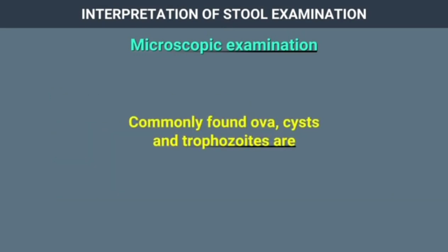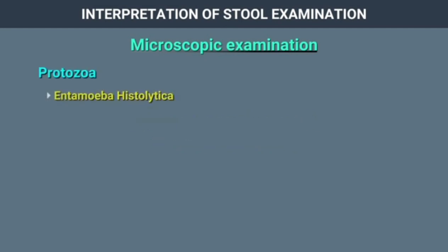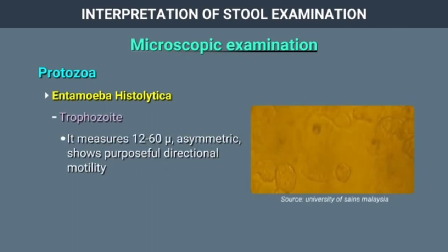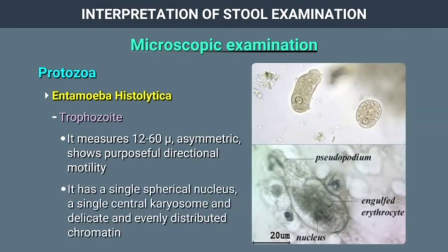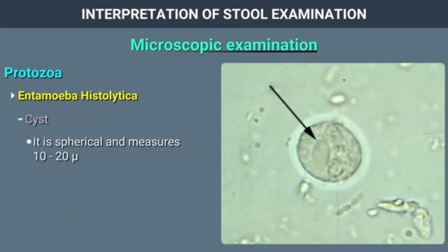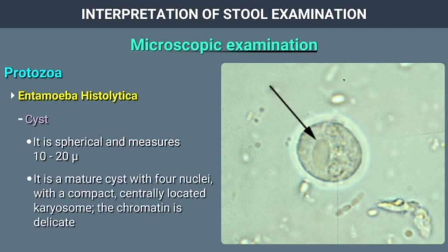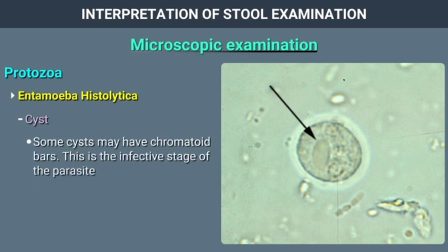Entamoeba histolytica trophozoite measures 12 to 60 microns in size. It is asymmetric, shows motility, and has a single spherical nucleus, a single central karyosome, and delicate evenly distributed chromatin. The cyst is spherical, measuring 10 to 20 microns. The mature cyst has 4 nuclei with a compact centrally located karyosome and delicate chromatin. Some cysts may have chromatoid bars. This is the infective stage of the parasite.